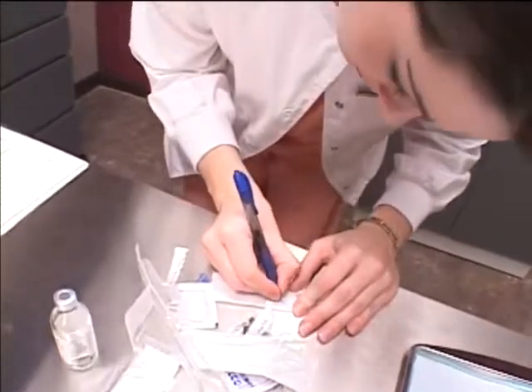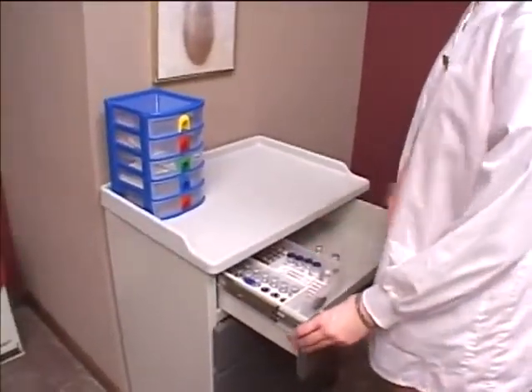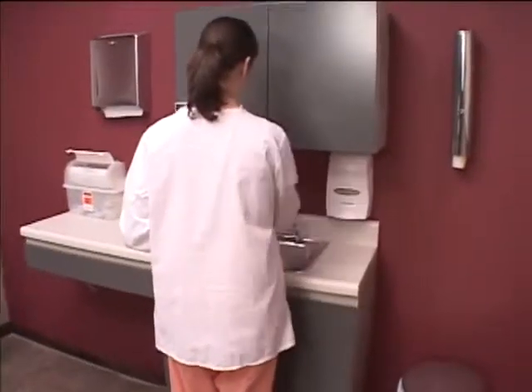Label the wrapper if necessary with the appropriate information. Return the diluent to its proper storage area. Dispose of the trash. Finish by washing your hands.